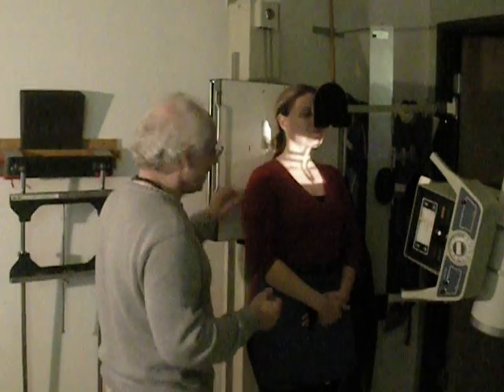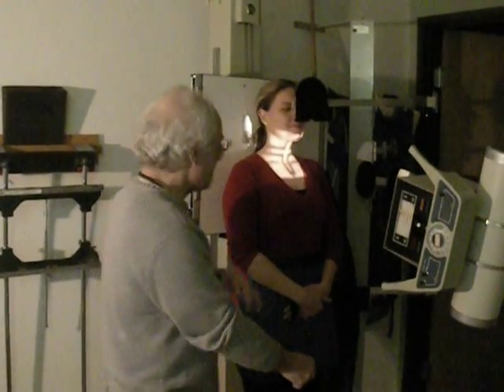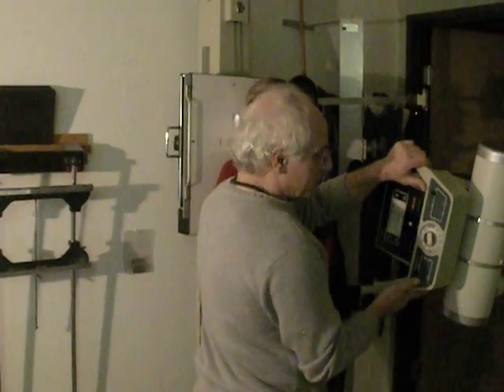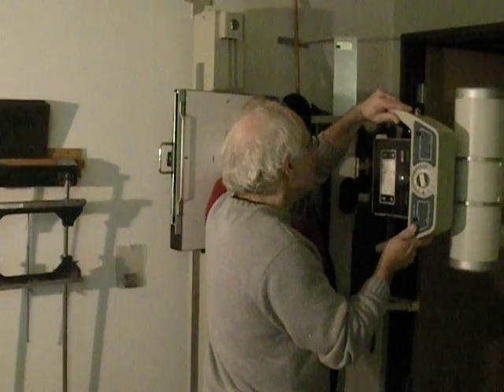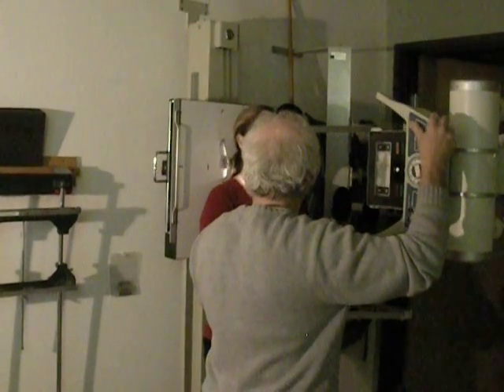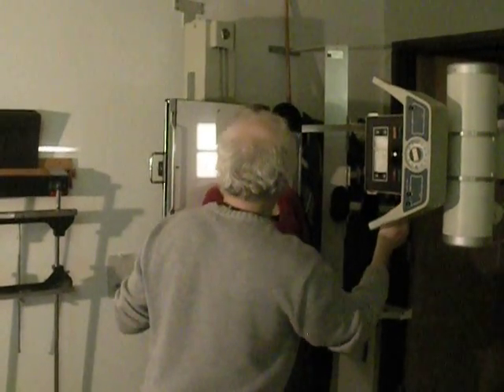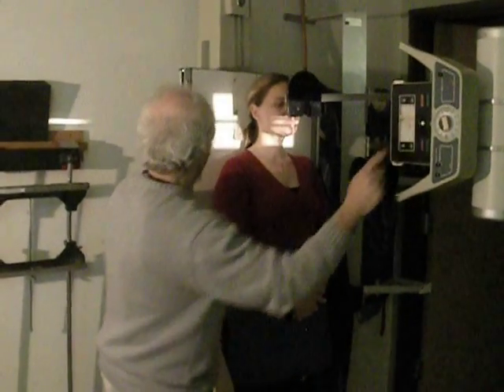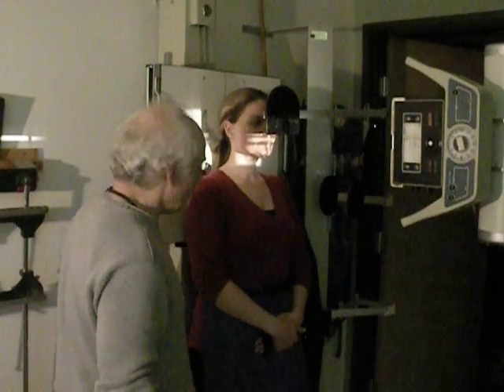We step back to the panel. Don't move, please. Beep. Did you get that? I did. And the patient is staying here because we instructed them to do so. This is the same body position. Now we're going to straighten the tube. We're going to bring this light up to the level of the lips. We can leave the eye shield there. And once again, we're going to make sure that our film is centered to our ray.